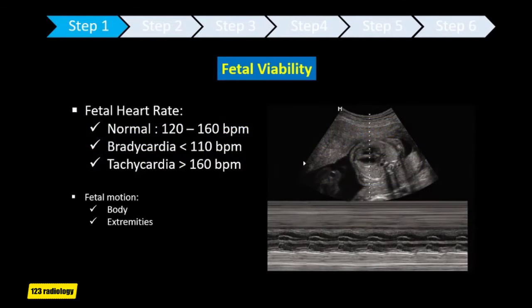Fetal viability is the first thing to look for. The normal fetal heart rate is between 120–160 beats per minute, depending on fetal activity. Abnormal heart rate and rhythm should be reported. Fetal bradycardia is considered when fetal heart rate is less than 110 beats per minute, and fetal tachycardia when it is more than 160 beats per minute. During the examination, you must see normal fetal motion of the body and extremities.